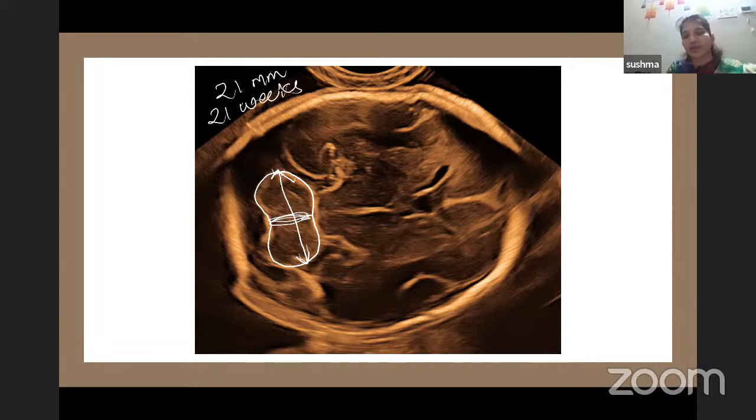This is very important when you do not know the gestational age of the fetus. For example, you have a fetus which is 25 weeks by LMP and there are no early pregnancy scans until the TIFFA scan or anomaly scan that we do. And BPD, HC, AC, FL are all very variable because it is a case of fetal growth restriction. Then the most important parameter that you can consider is the transcerebellar diameter, and you have to check if it is correlating with the gestational age.